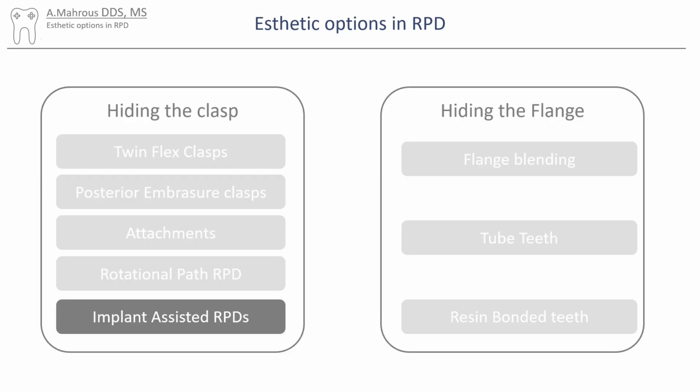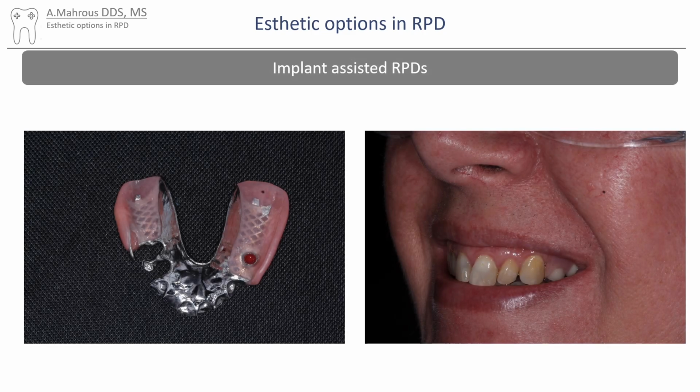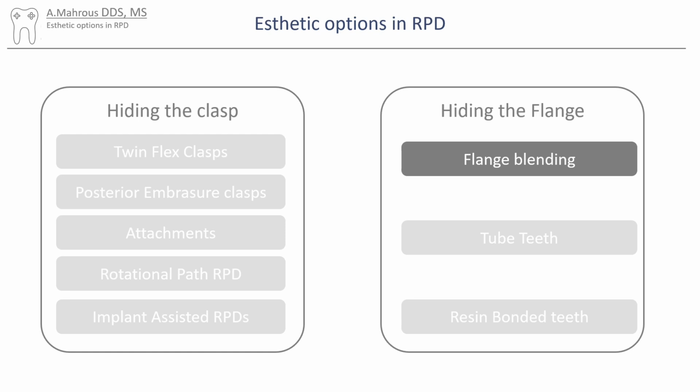The last option for hiding the clasp is using implant-assisted RPDs. Locator attachments commonly used to retain overdentures can be used for implant-supported RPDs specifically for retention. It's important to note that support through a rest is still needed on the adjacent tooth. Now let's move on to techniques of hiding the flange.